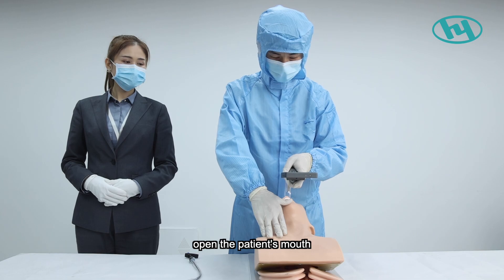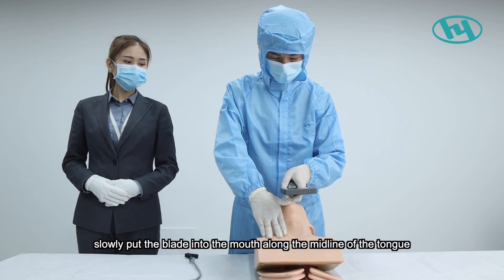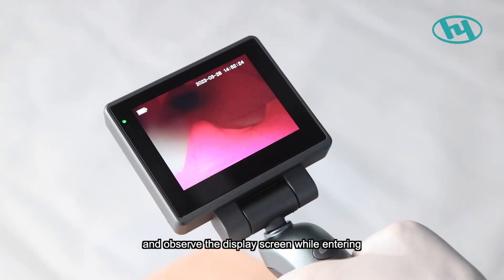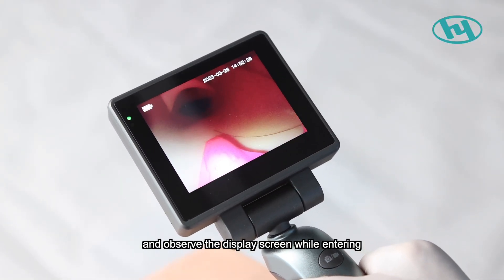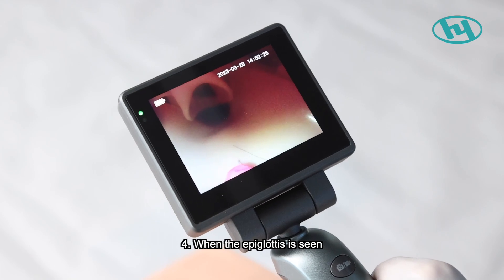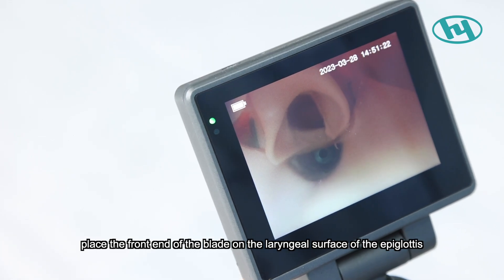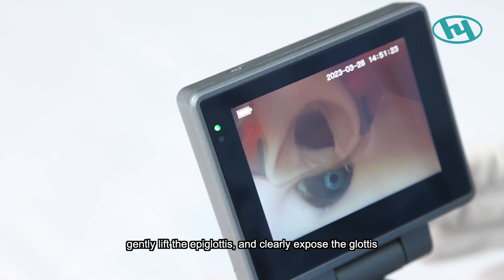Step three, place the patient in the supine position, open the patient's mouth, and slowly insert the blade into the mouth along the midline of the tongue while observing the display screen. Step four, when the epiglottis is seen, place the front end of the blade on the laryngeal surface of the epiglottis, gently lift the epiglottis, and clearly expose the glottis.